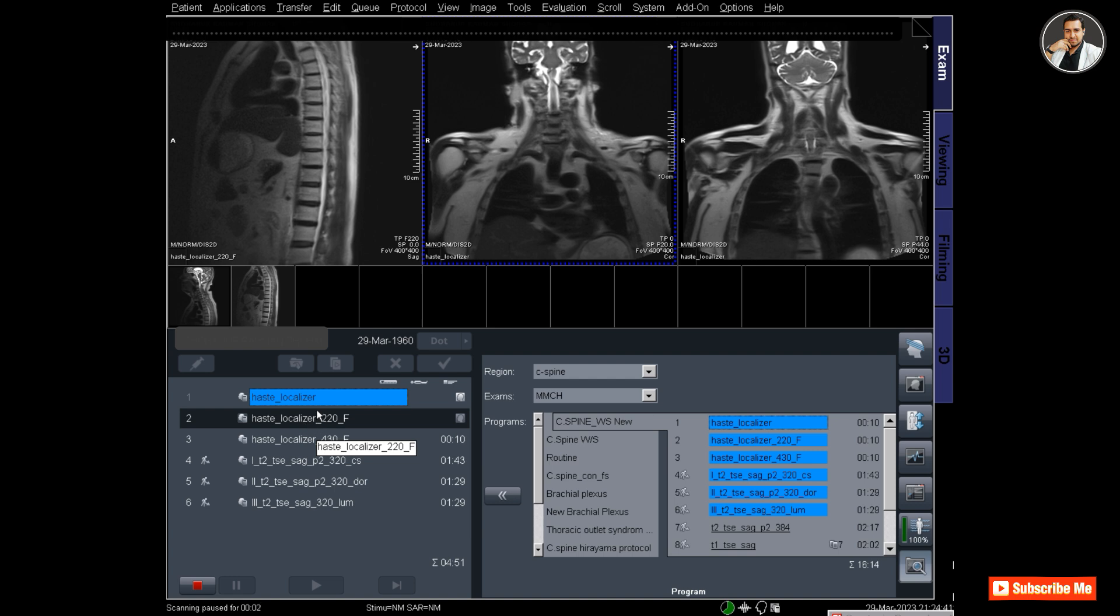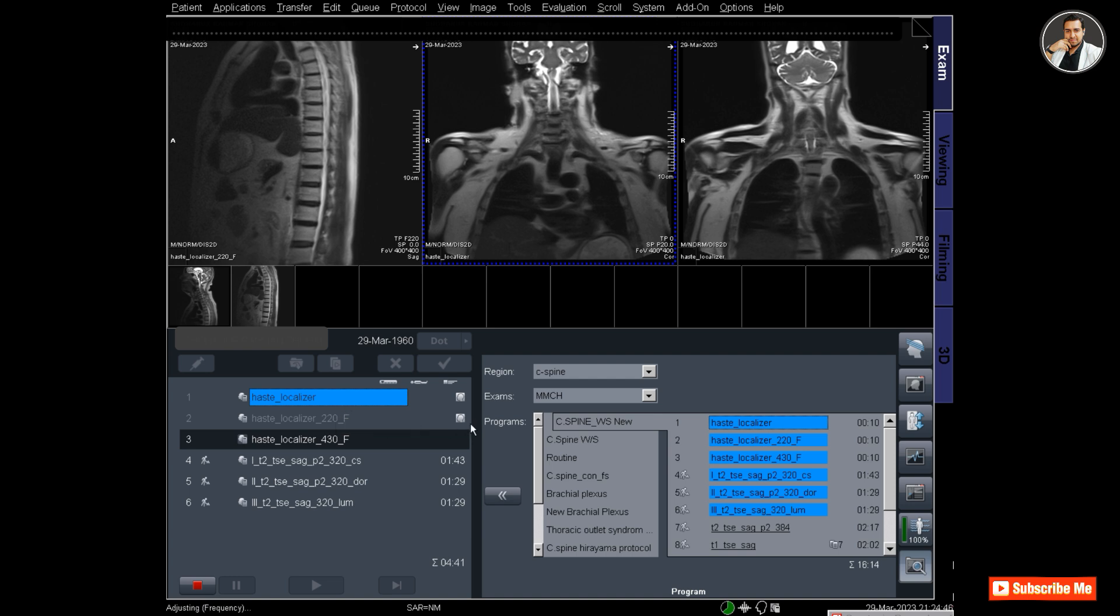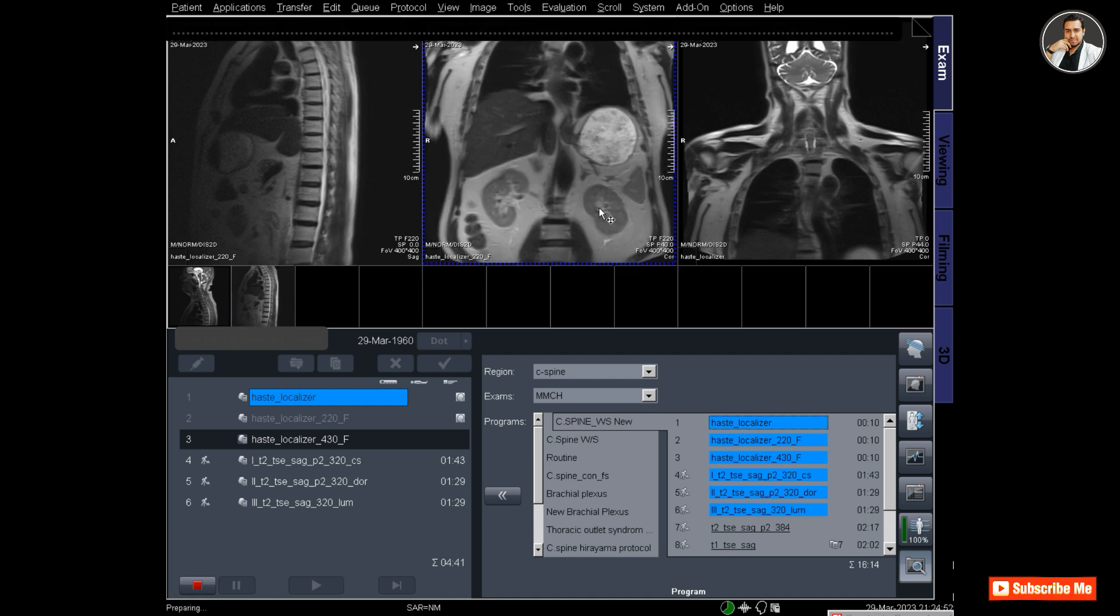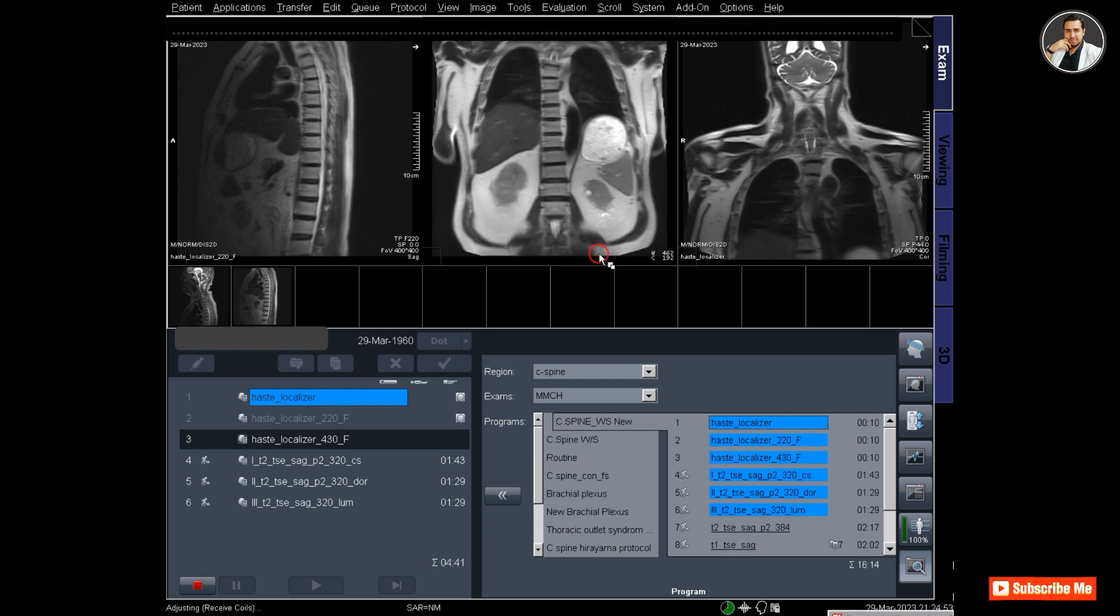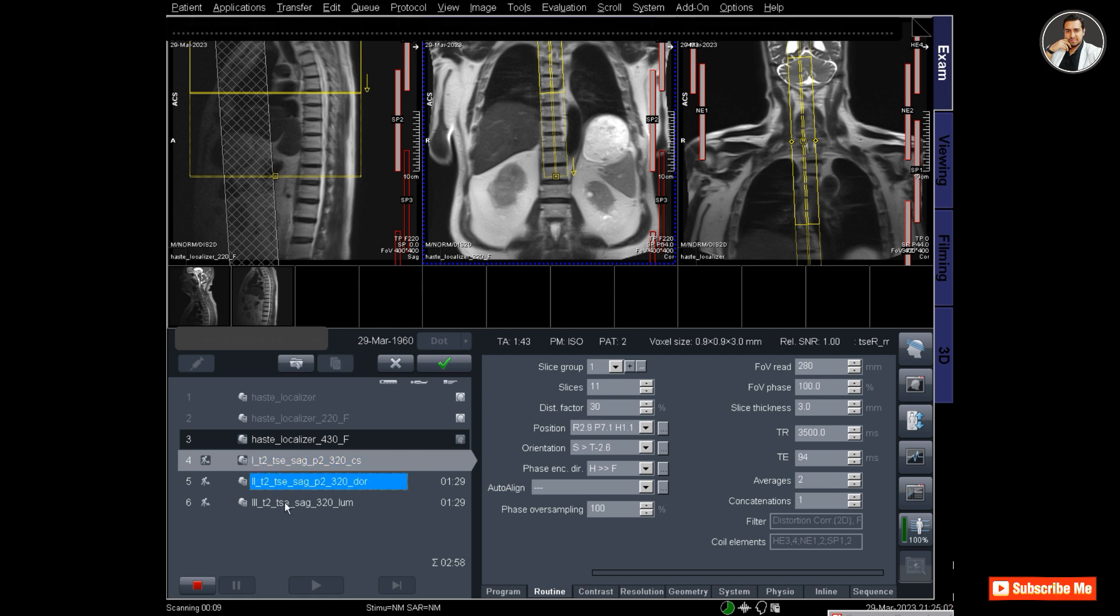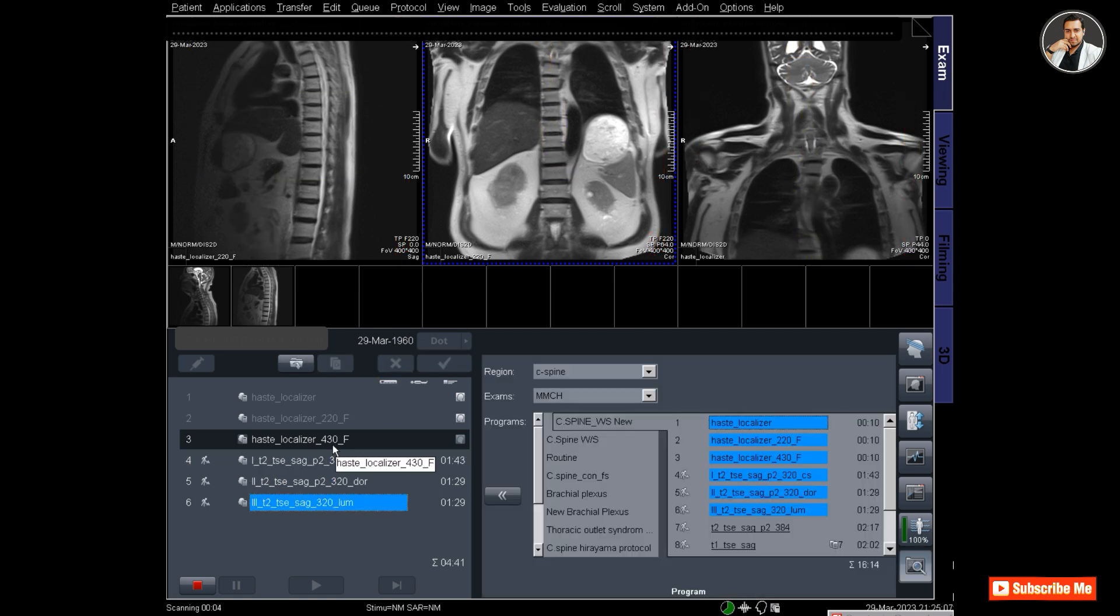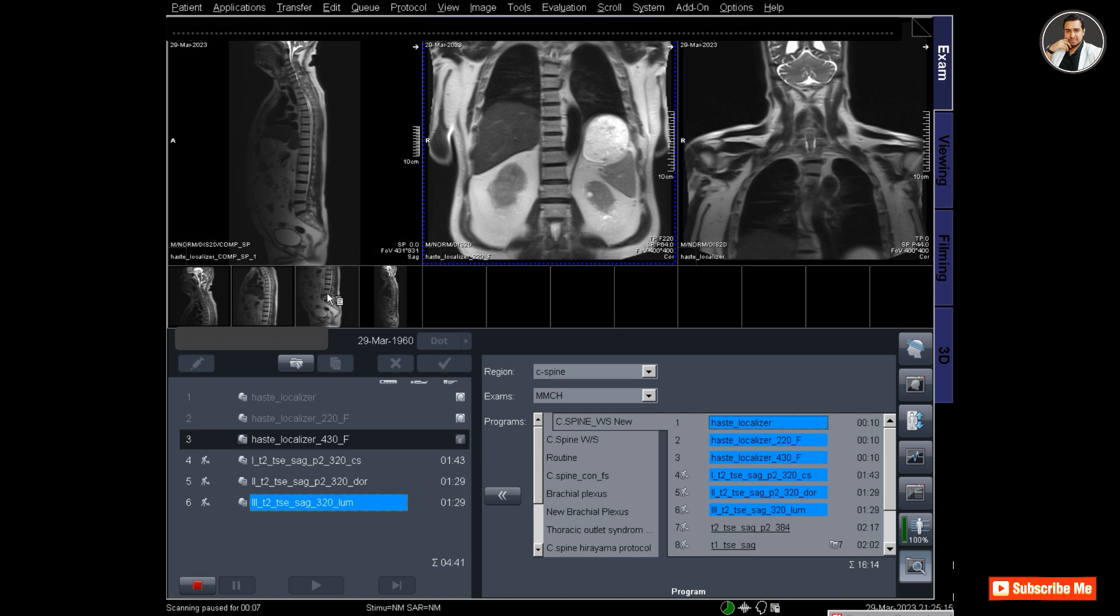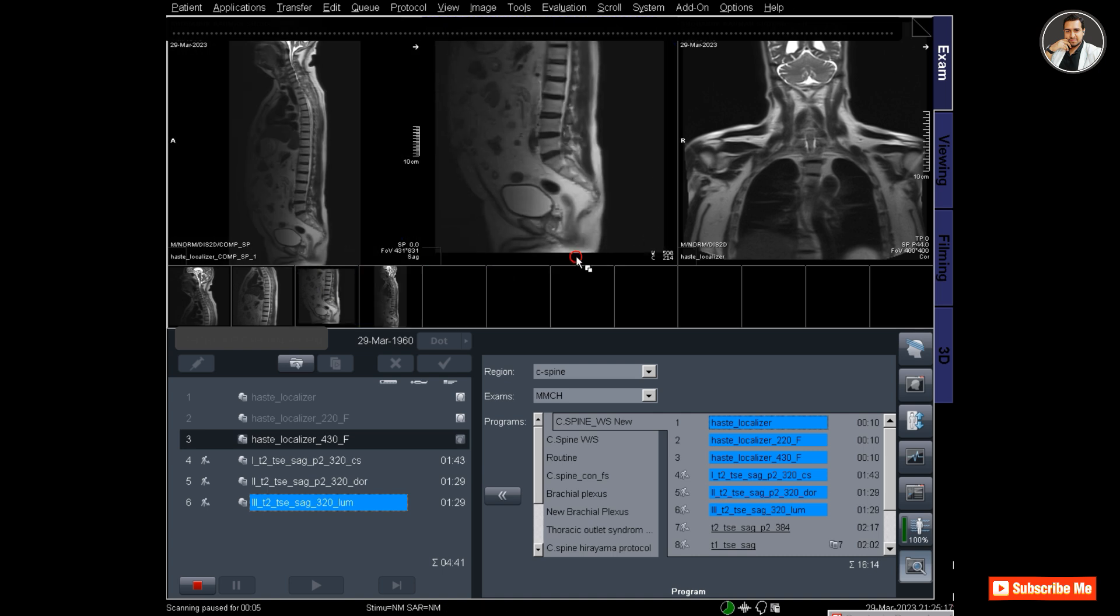The dorsal localizer has scanned and now the lumbar spine localizer is running. You can see the dorsal spine localizer showing here in sagittal and coronal views. These three localizers will compose together to make a Whole Spine localizer.